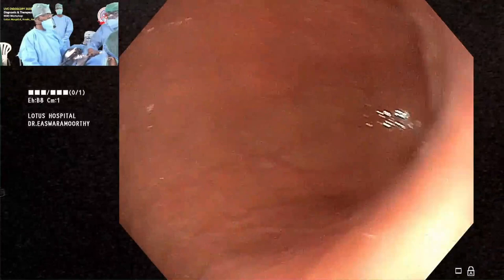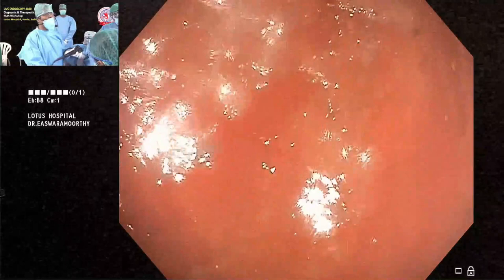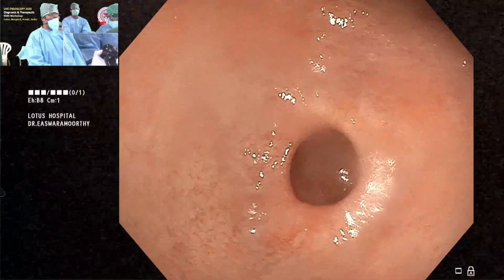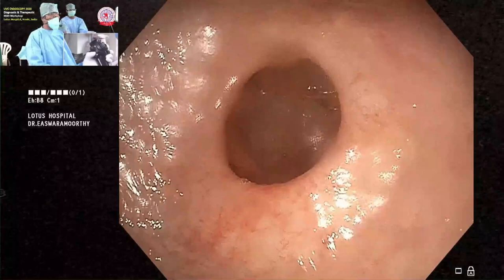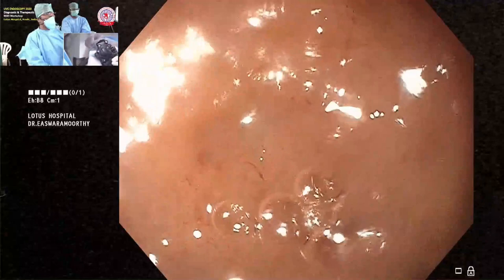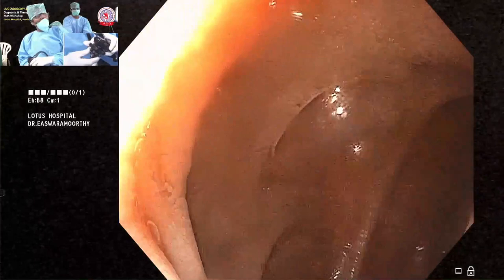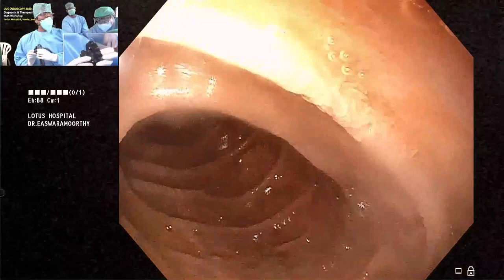As you advance further, continue walking along the greater curve. Turn the big wheel toward you, which brings the pylorus toward you — place it right at the center of the screen so the scope is facing it directly. Then you can enter D1. You can see some scarring and duodenal erosions here. Turn the small wheel away, then the big wheel, and advance further — there is no obstruction now, only minimal scarring — you can go right into the second part of the duodenum.